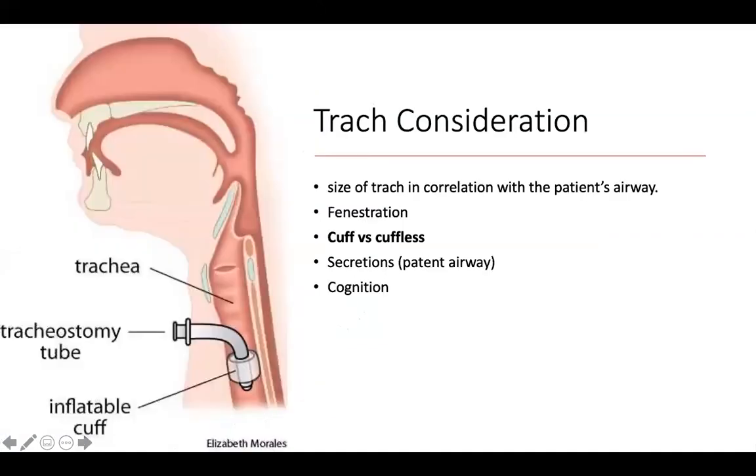Okay, so what to consider when you're putting a speaking valve on? We're going to talk about when the patient is ready for a speaking valve, and what the contraindications of a speaking valve are.